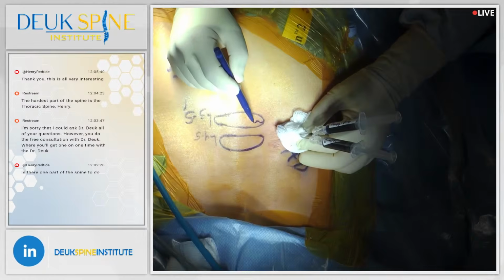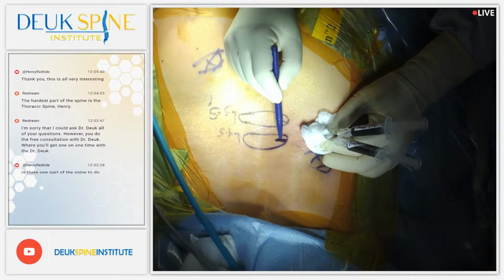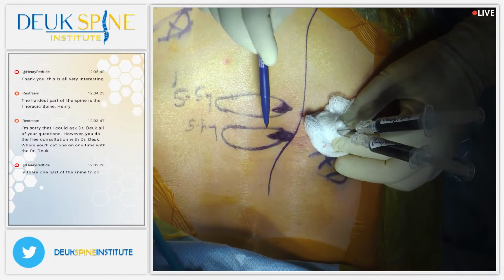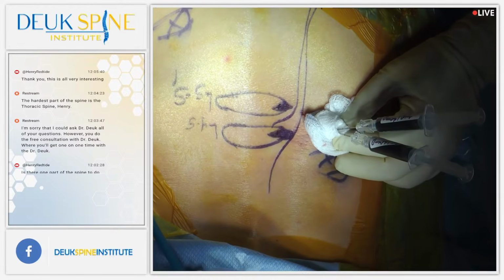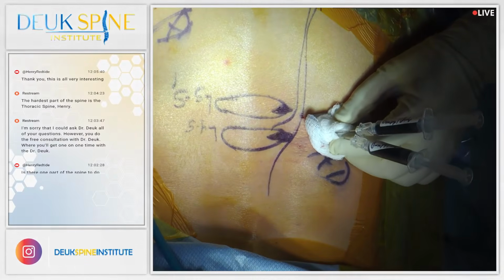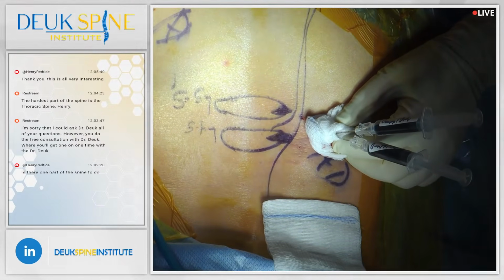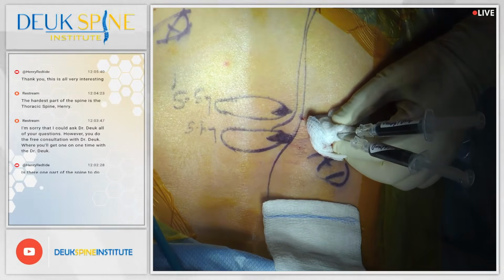It's the actual tear in the annulus, that's what I'm showing you with this wave, that allows fragments of nucleus to get stuck in the tear and bulge out. It's not pinching of the nerves going down her legs that cause the back pain. Back pain comes from inflammation in the tear. That's what I discovered here at Deuk Spine. I'm Dr. Deukmedjian, the founder at Deuk Spine and the one who figured out where back pain comes from. And we've been fixing it for 20 years at Deuk Spine because we're going in and treating the tear with a laser, debriding it.